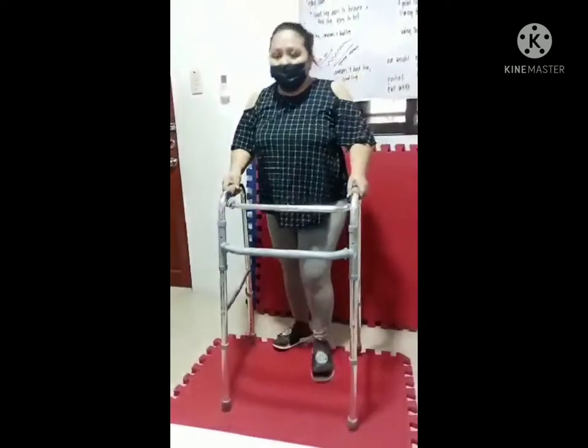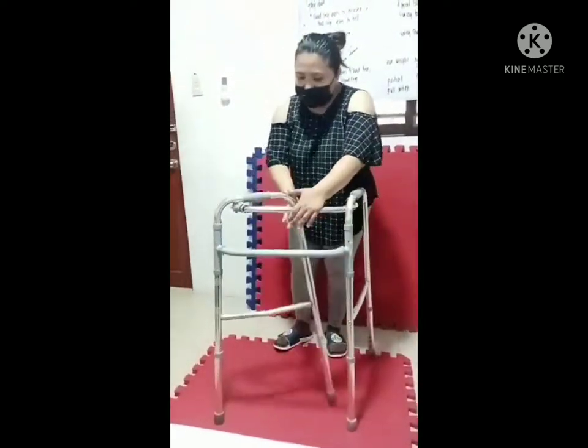To close the walker, you just need to find the push button, push it, and then close both sides. Pull both sides.